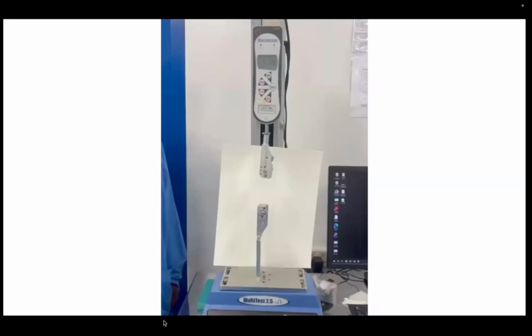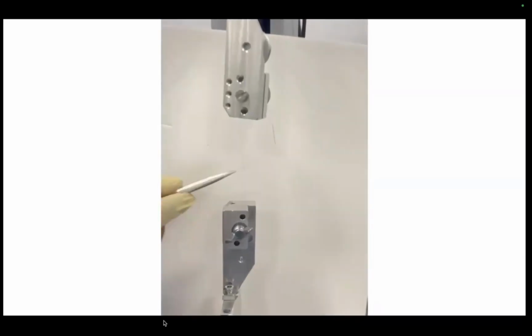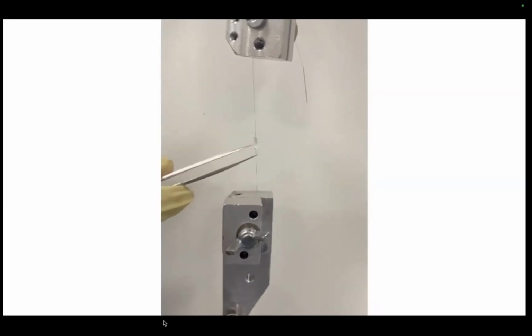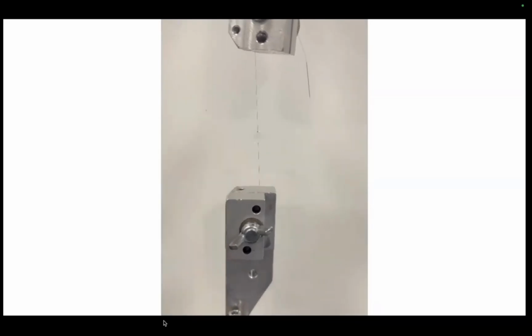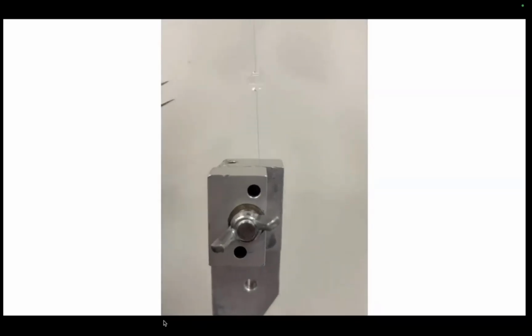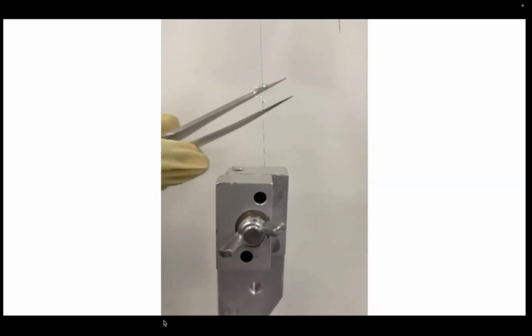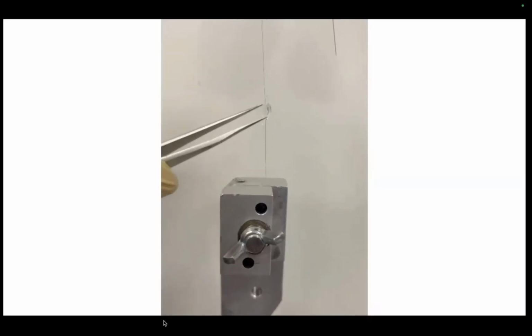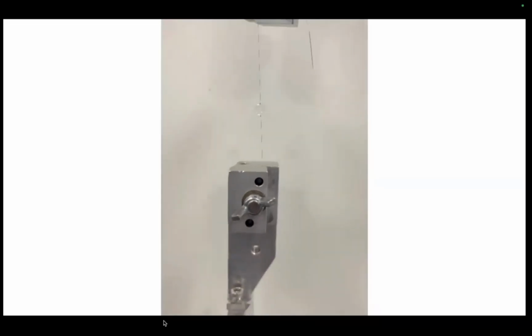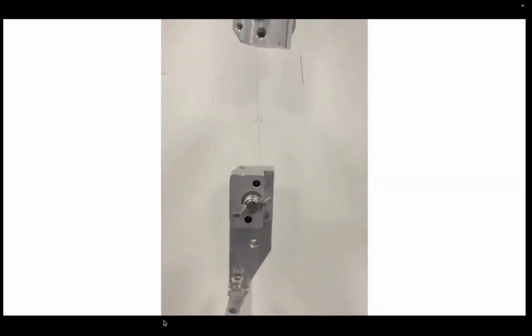And the one common question that everybody has is whether the IOL is going to be stable or is going to be moving inside the eye, because it is a 2-point fixation. So it doesn't move, as you see in this video, unless disturbed. Unless you touch the optic, the IOL is not at all going to move. It's going to be really stable. I don't have a video of the post-op, I think I added it for a future presentation. The IOL is very stable. So unless there is a big trauma or unless somebody is going to touch the IOL, you don't have to worry about wobbling or tilting of the intraocular lens.